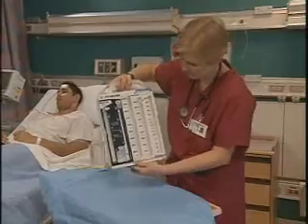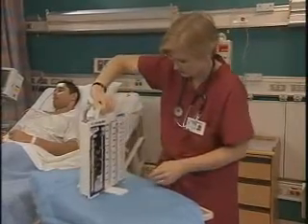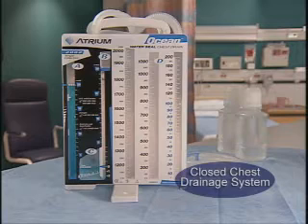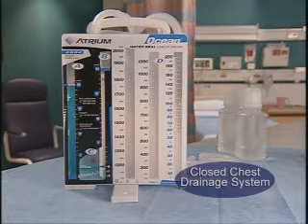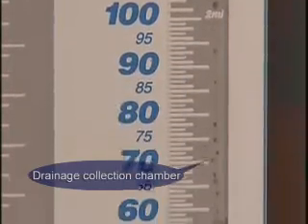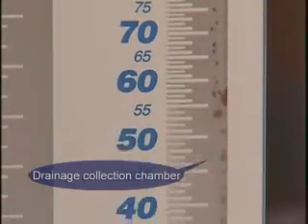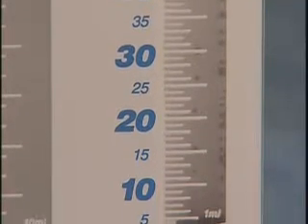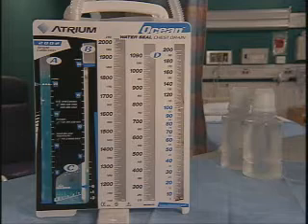To understand how this type of system works, consider its components. A disposable drainage system usually has 3 chambers, each with a different function. The drainage collection chamber collects and measures blood or other fluid that drains from the pleural or mediastinal space. It usually has at least 2 compartments to capture large amounts of drainage.